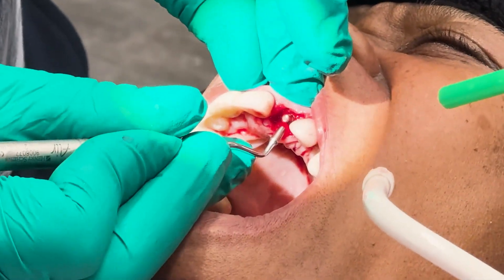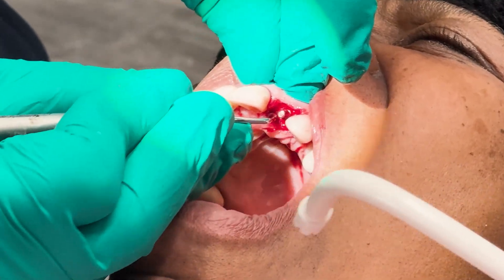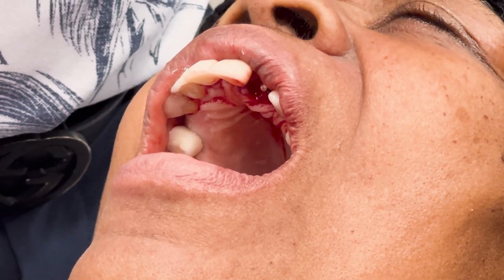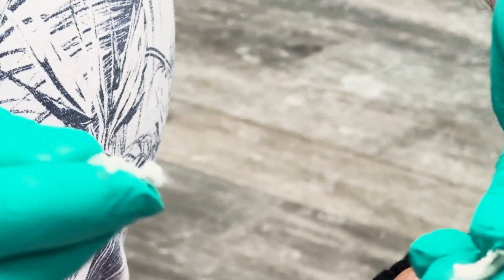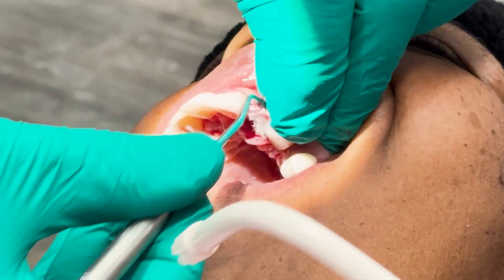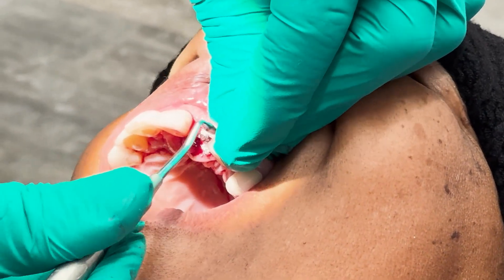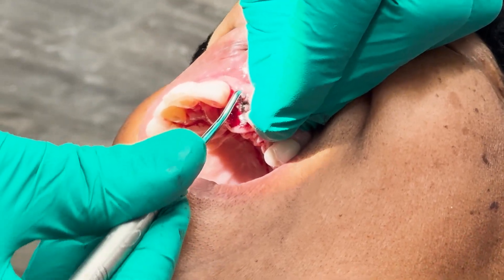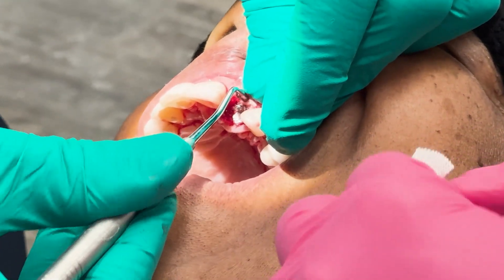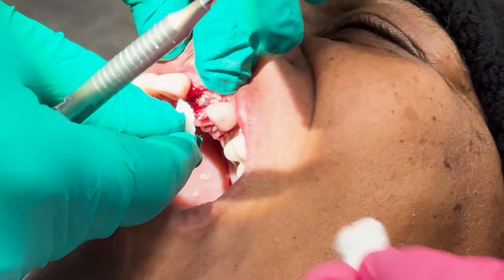The new Shacken First bone plug will be available for purchase within the next couple of weeks. Most of you have tried our Hemostip product — this is the resorbable packing material that I like to put on top of the bone plug. That's the Shacken First Hemostip product. We pack that right over the bone plug, which keeps the bone in place and also helps to form a clot. I'm going to put one more piece in, just roll it up and put it around the implant.